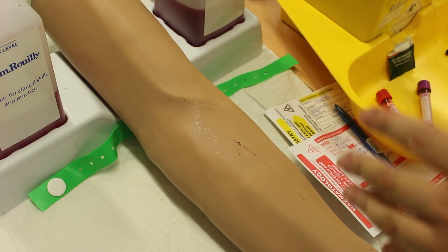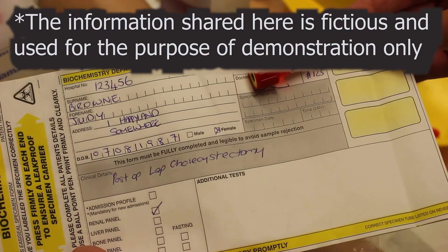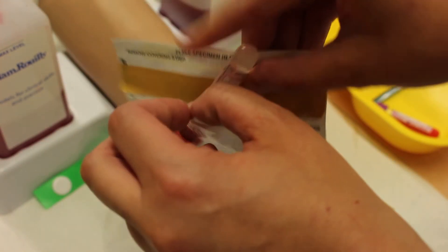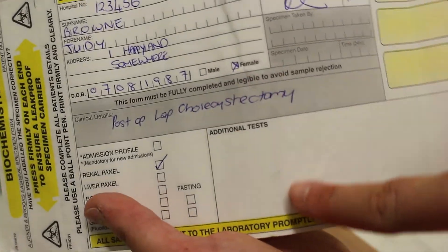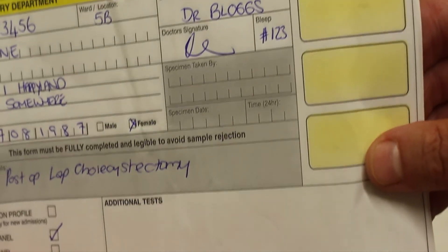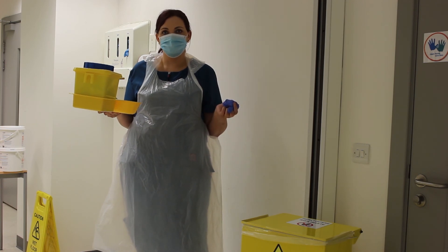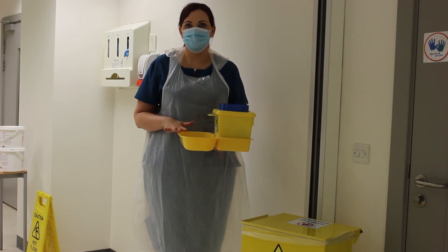Once bleeding has stopped, gather the gauze into your glove and remove both, placing them into the clinical waste bin. Apply a band-aid if required. Make sure the correct bottle goes with the correct form, that the bottle is fully labeled at the patient's bedside — this is very important. Pop it into the plastic bag, peel off a sticker to seal it. Ensure the form is fully completed with specimen date, time, and the name of the person who took it. Then leave the patient zone, dispose of all high-risk waste, remove PPE, go to the clean utility, and clean down your tray.